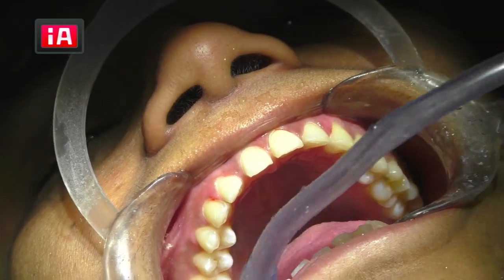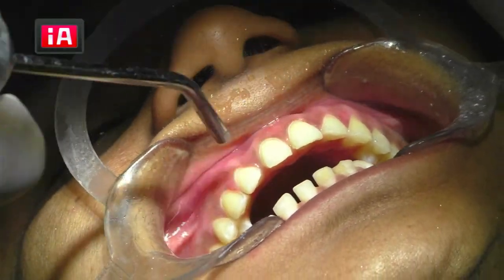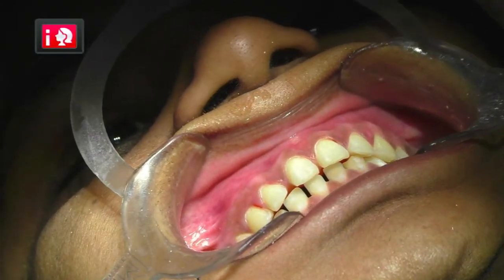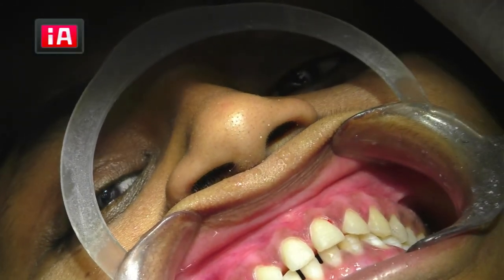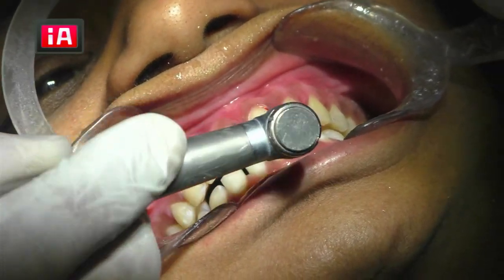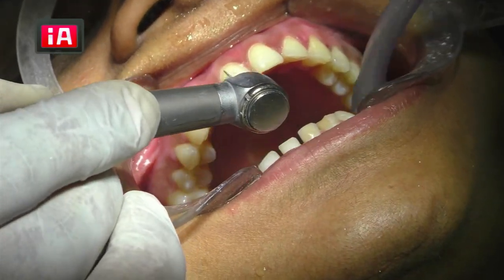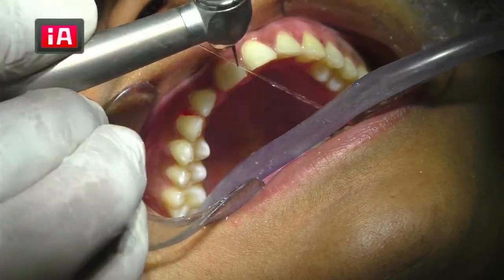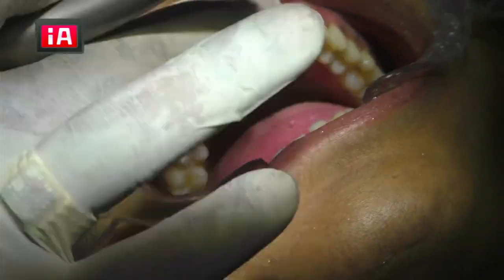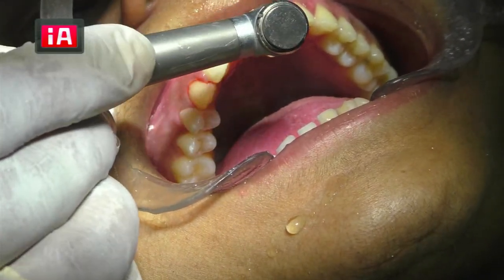About the preparation. Okay. So, very thin margin. Hardly, I have reduced the tooth structure very, very minimally. This is a margin from here.